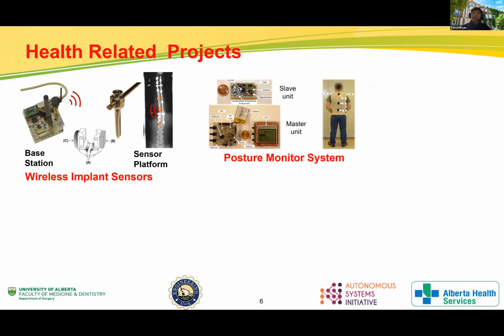The orthopedics first asked, can we build some monitor system that can monitor the children's posture and provide feedback? The reason is some of the children have spinal curvature. If you teach them, they will be able to correct themselves instead of doing brace treatment or surgery.